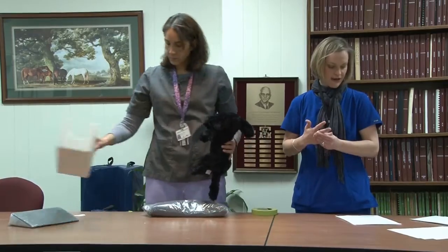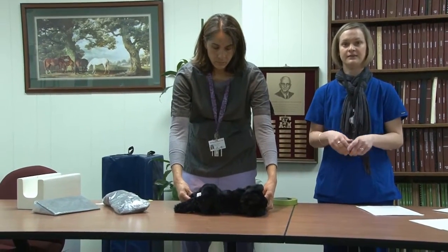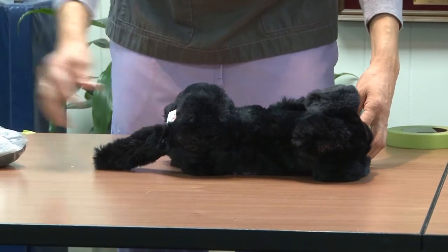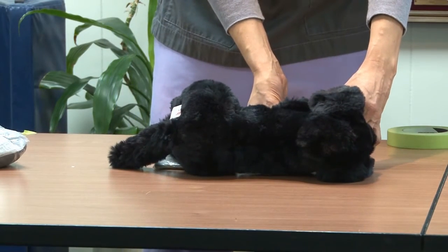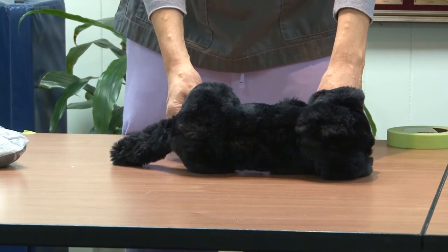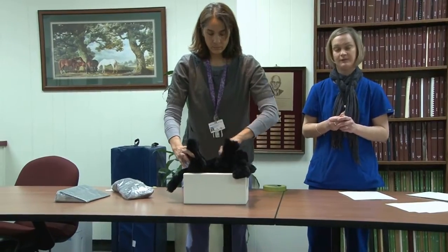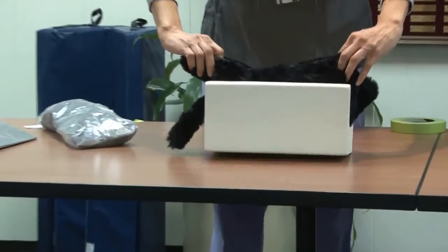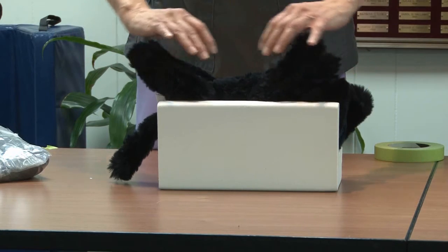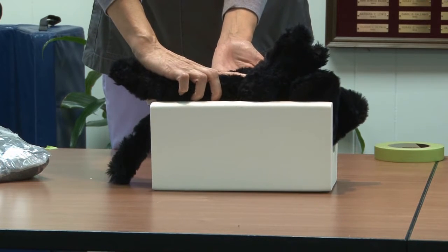Next is the lateral abdomen. Again in right lateral recumbency, extend the front legs cranially and the back legs caudally, and ensure the patient is not rotated — use a wedge on the sternum or back depending on how they're rotated. For the VD ventral dorsal abdomen, place the patient in a trough just like the thorax. Extend front legs cranially and back legs caudally, making sure the patient is not rotated by feeling along the bottom of the spine and the sternum to confirm they are perpendicular with the table.